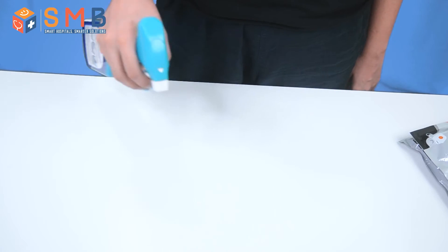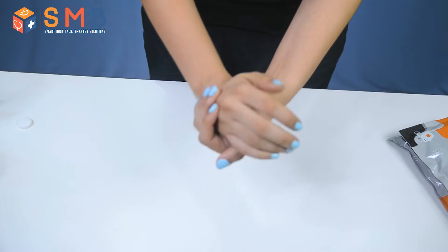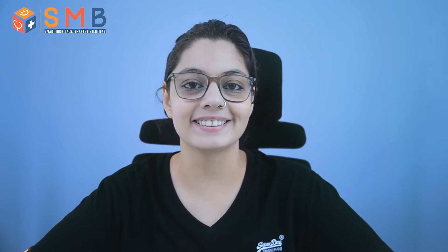Before taking the test, disinfect the area of testing. Make sure your hands are clean and dry. Turn on the app. And boom! You are ready to take the test.